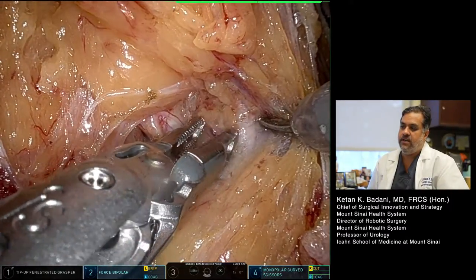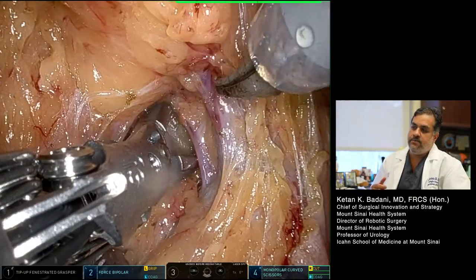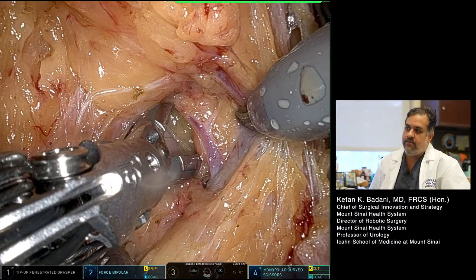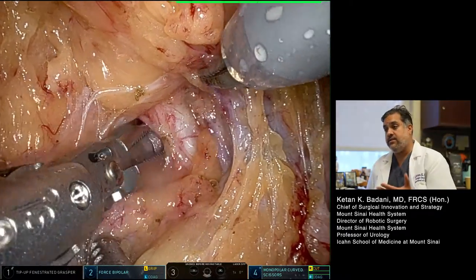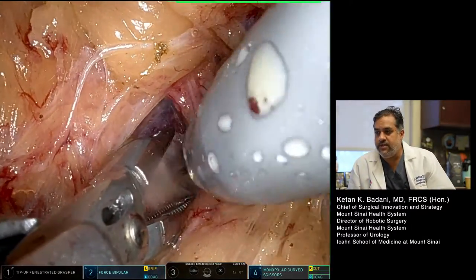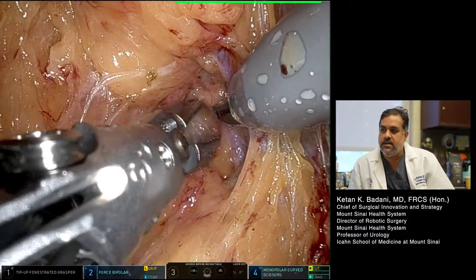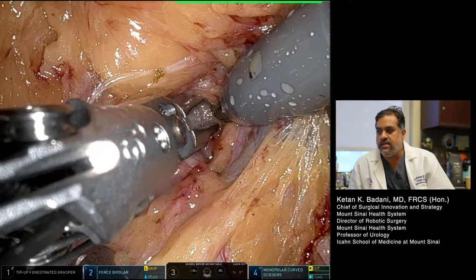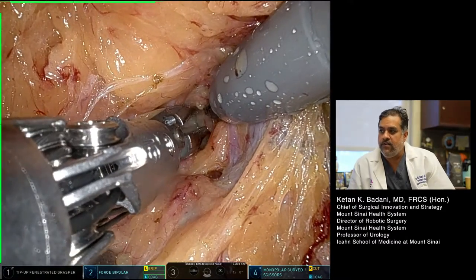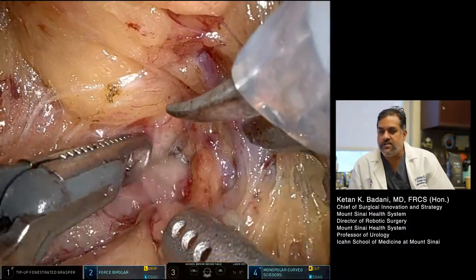You see the artery and vein being dissected. In a partial nephrectomy you don't necessarily have to dissect out the vein, but on the right side — because it's a short renal vein, close to the vena cava, and it's an endophytic tumor — you may see significant back bleeding, so clamping the vein is reasonable. It's very important to take your time and skeletonize the renal artery. You want the bulldogs to sit on there correctly and cause the appropriate occlusion. If you don't skeletonize the renal artery, the quality of the ischemia is not going to be as good.